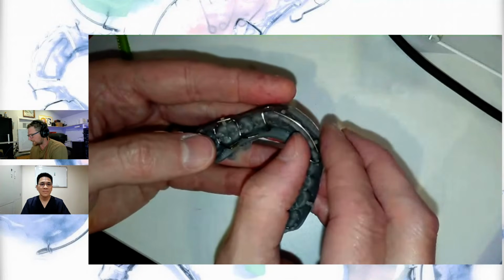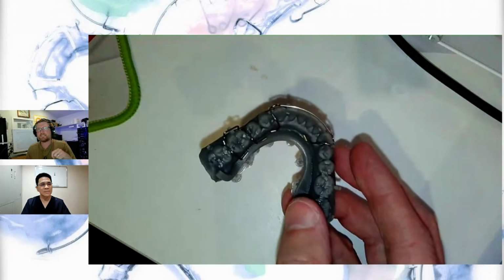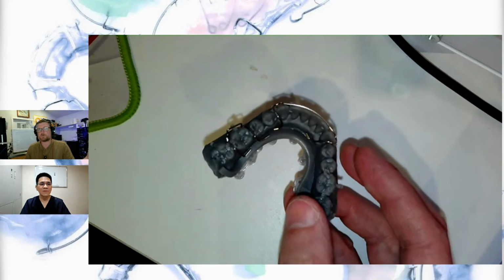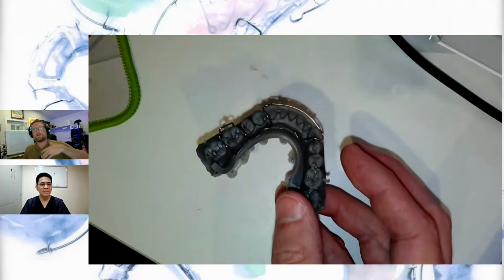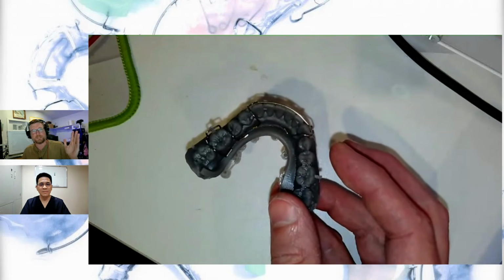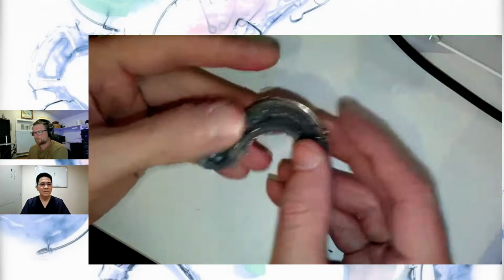I want to say this. I haven't seen any other wire bending software that can do the model editing also. This is the first I've seen. Now, I'm not very prolific with a bunch of software that I use, but this is the only one I've seen that does the complete procedure, start to finish.